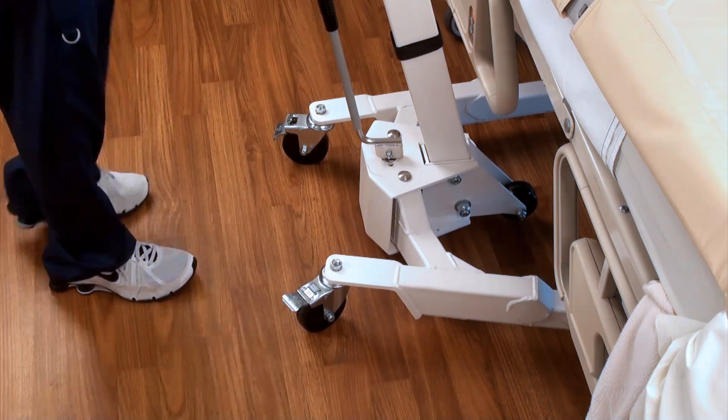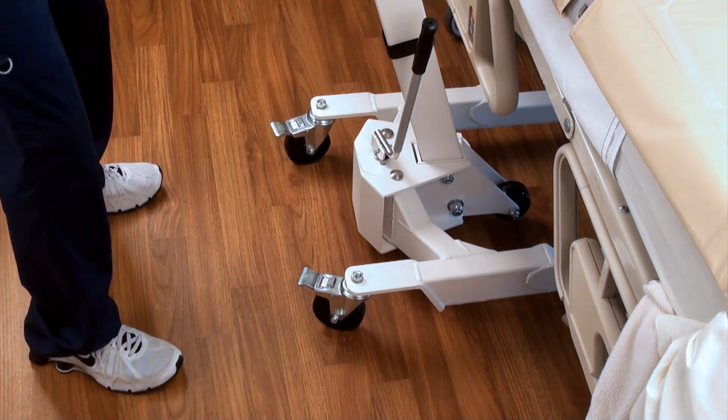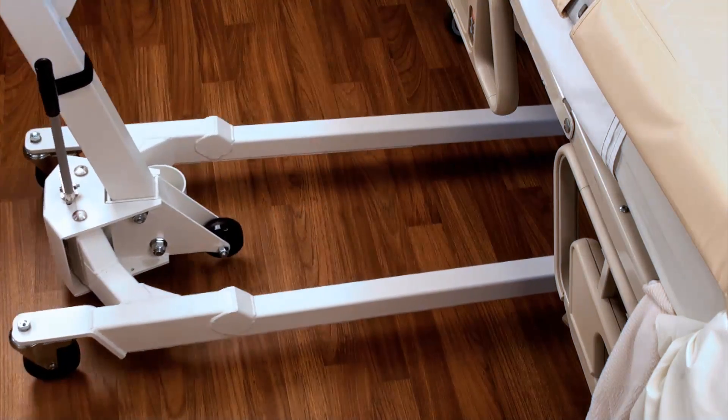Unlock the wheel brakes and set the stance to narrow once more using the stance adjustment handle on the base. Roll the scale away from the patient's bedside and chart the weight.